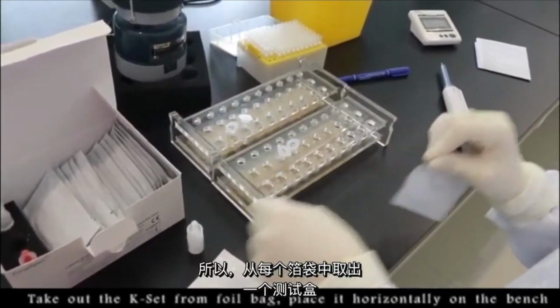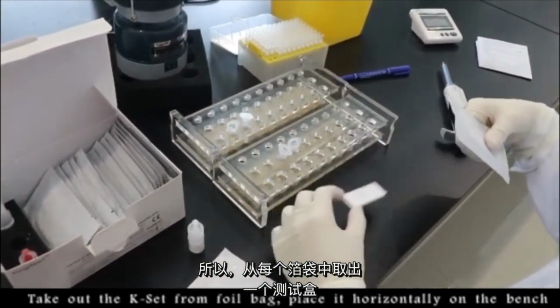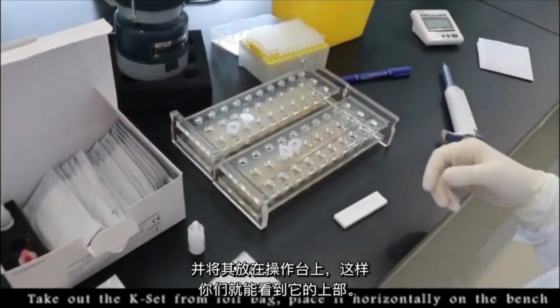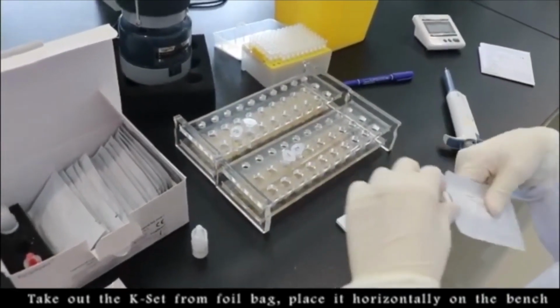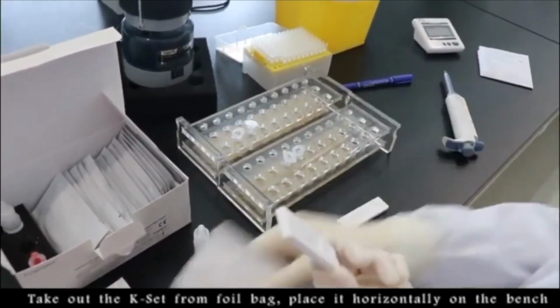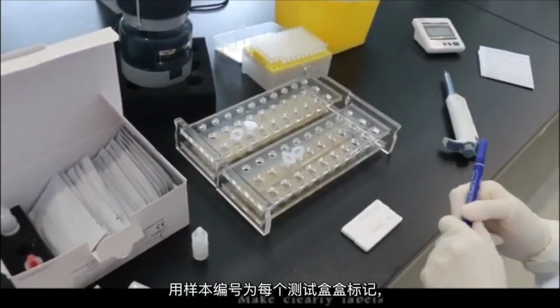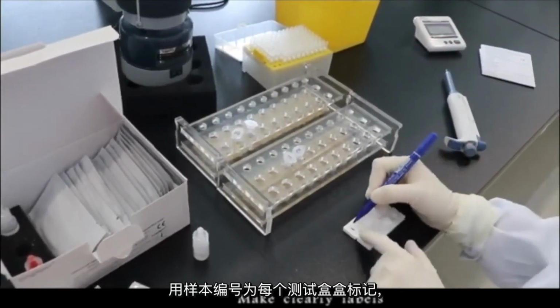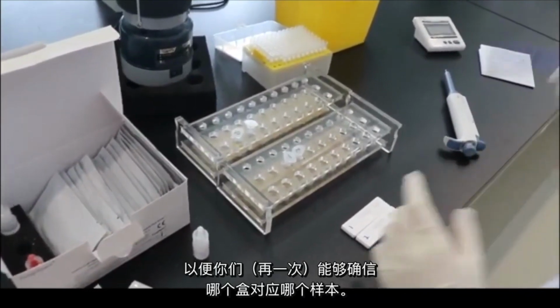So take one of the cassettes out from each foil bag and place it on the bench so that you can see the upper side. Label each cassette with the sample number so that, again, you're confident which sample is which.